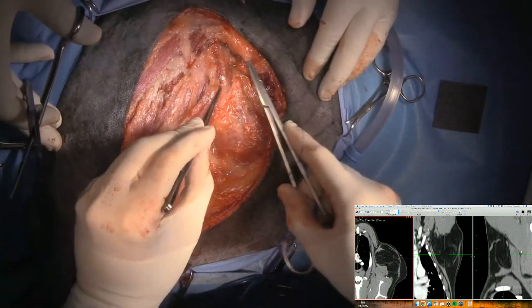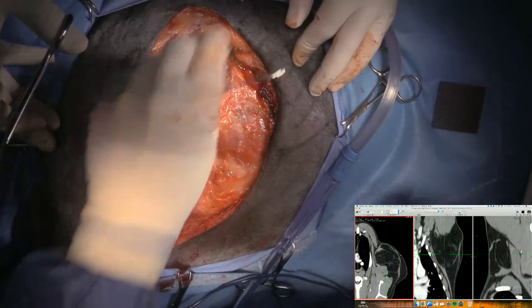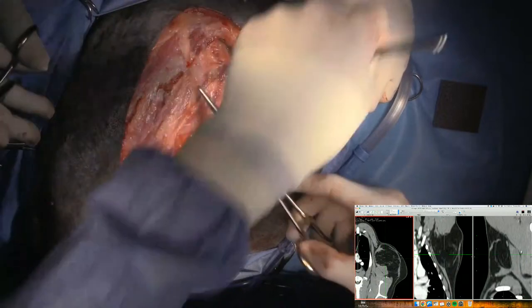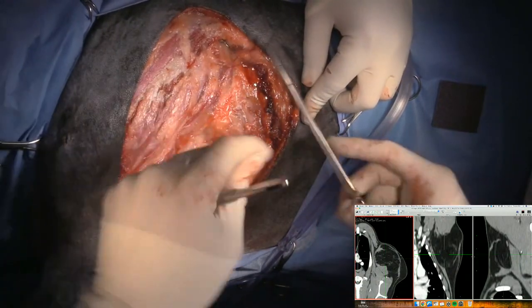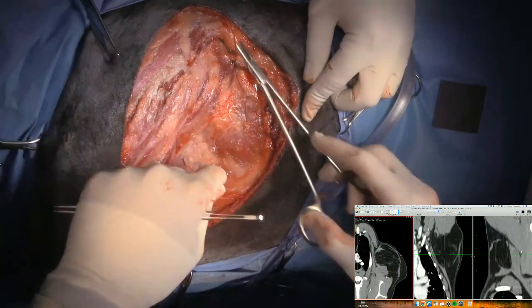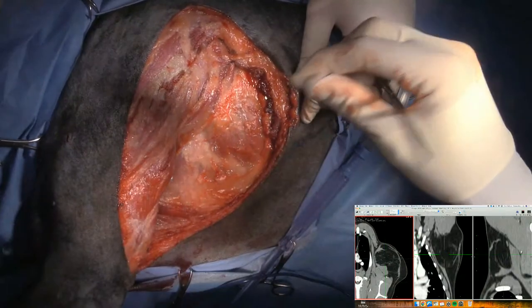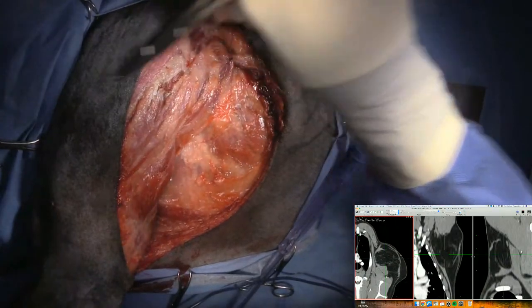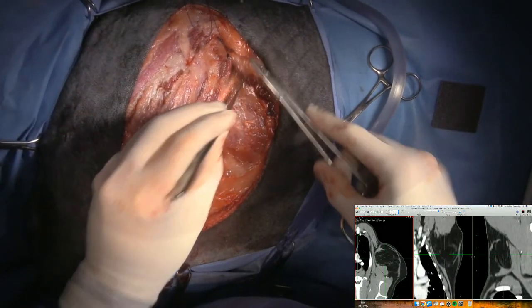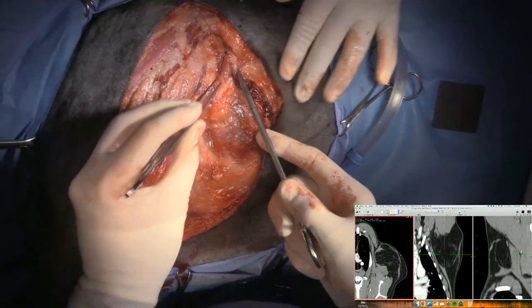See if I can reattach that latissimus to the back of this caudal edge of the muscles attached to the scapula, which may help a little bit with function, even though there usually is no major functional impairment with this. It may still help a little bit. I will not be putting a Jackson Pratt drain in. I've got no real serous oozing or anything like that. I'm going to do a good job of closing my dead space.